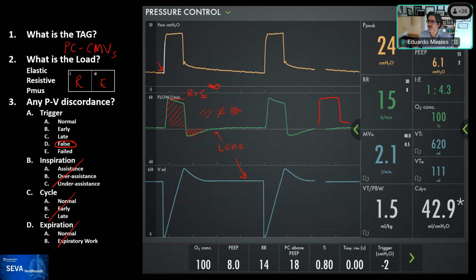Yeah, in this situation, pressure control, because you're trying to inflate an open system, right? So you're trying to inflate the balloon to a certain size, and the only way to pressurize that is by a very high amount of flow. So trying to do that with volume seems a very hard thing to achieve.